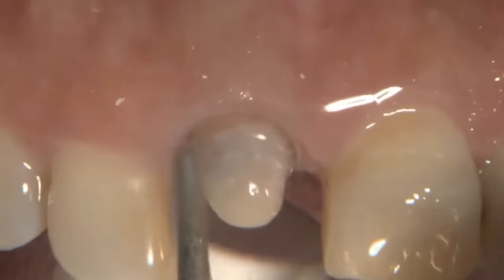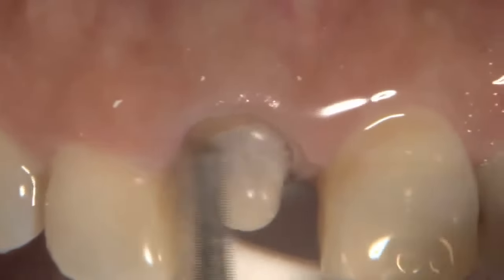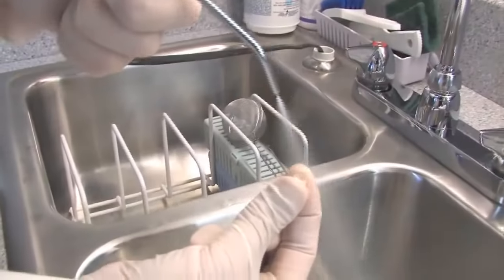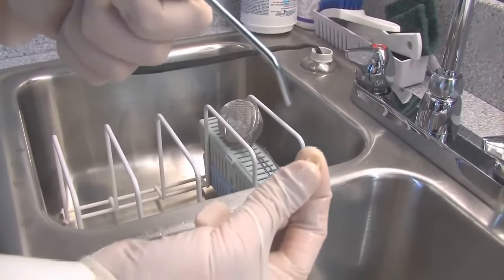The temp bond comes off pretty easily. This is just something I do with the sonic scaler to make sure that I've got that preparation as clean as possible after the temp's been on for a couple of weeks.